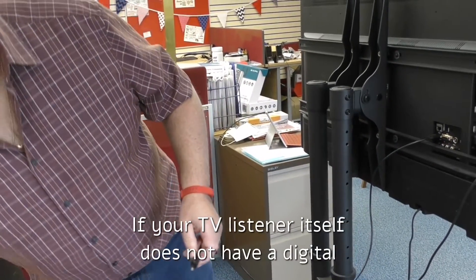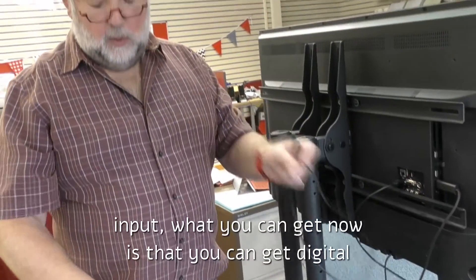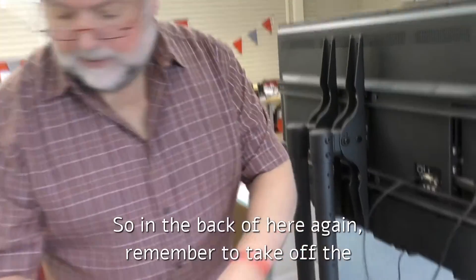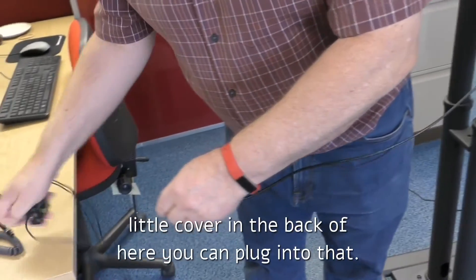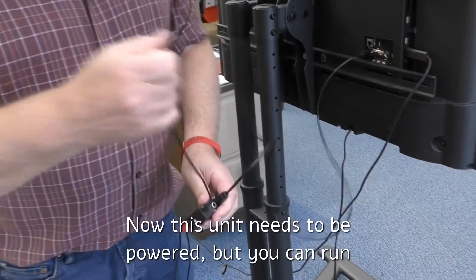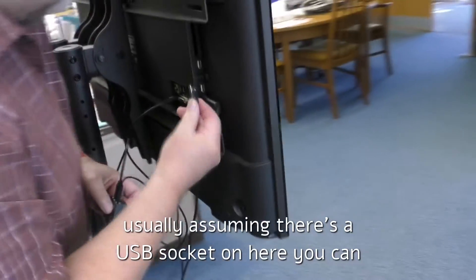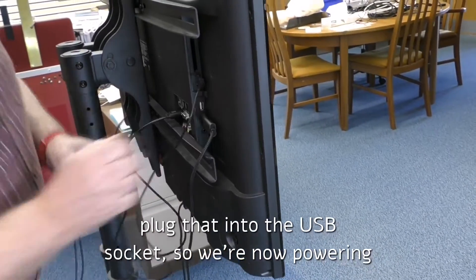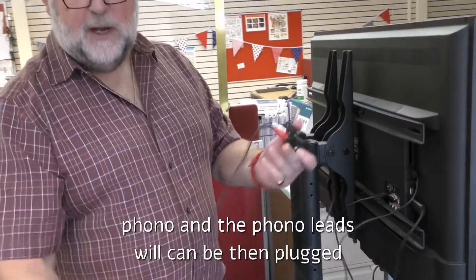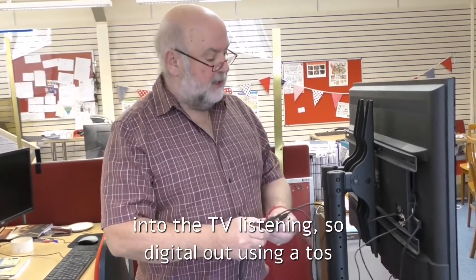If your TV listener itself does not have a digital input, you can get digital-to-analog converters. In the back of here — remember to take off the little cover — you plug into that. This unit needs to be powered, but assuming there's a USB socket on the TV, you can plug it into that USB socket. So we're now powering this product off the TV itself, and it comes out via phono, and the phono leads can then be plugged into the TV listener.